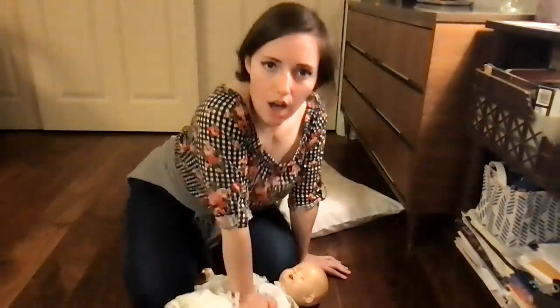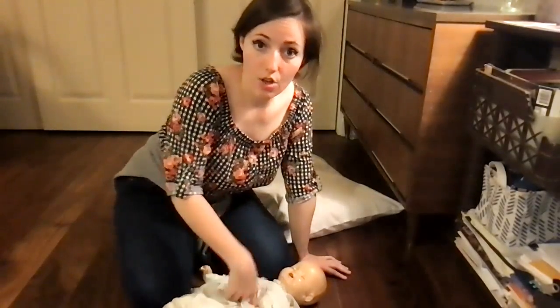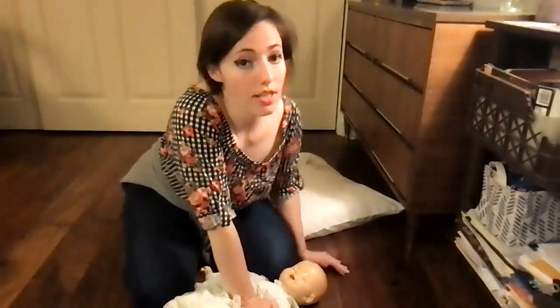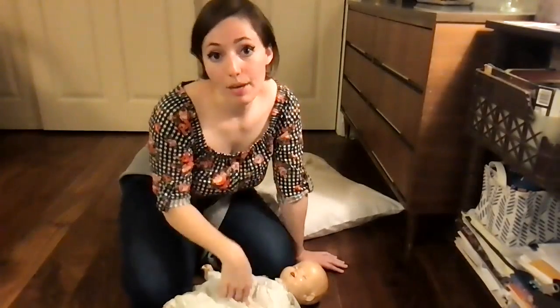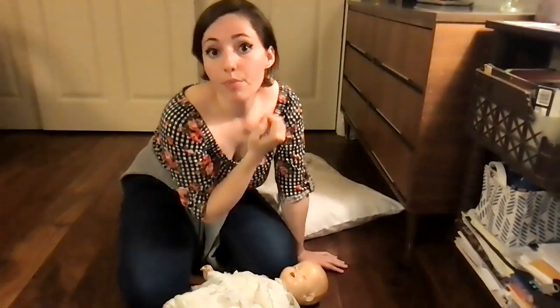Then eventually, for this scenario, it'll say shock advised, charging. While it's charging, you can go back to giving compressions. What it's doing is building up power to give a shock to the patient, but it won't shock until you press the button that says shock. In between, you can be giving compressions, because remember, the shorter your compression breaks are, the better chance of survival your patient has. So once it says shock advised, you're gonna go back to giving CPR until it says don't touch the patient, or clear patient, or something like that.